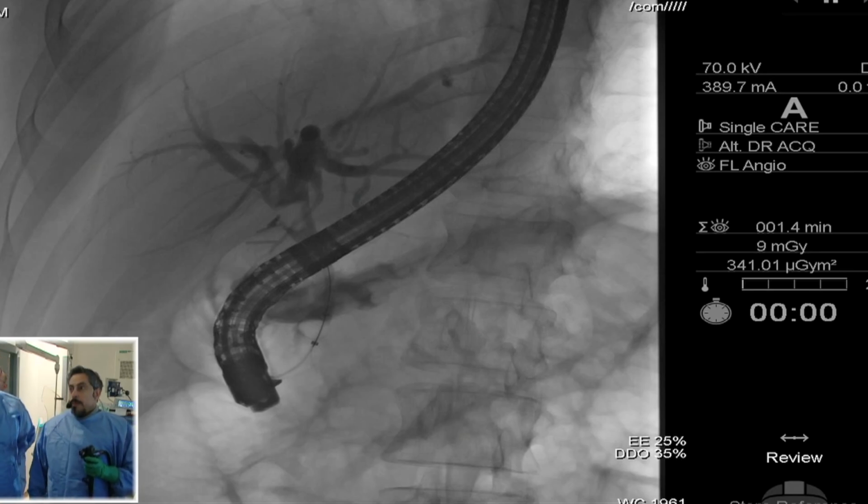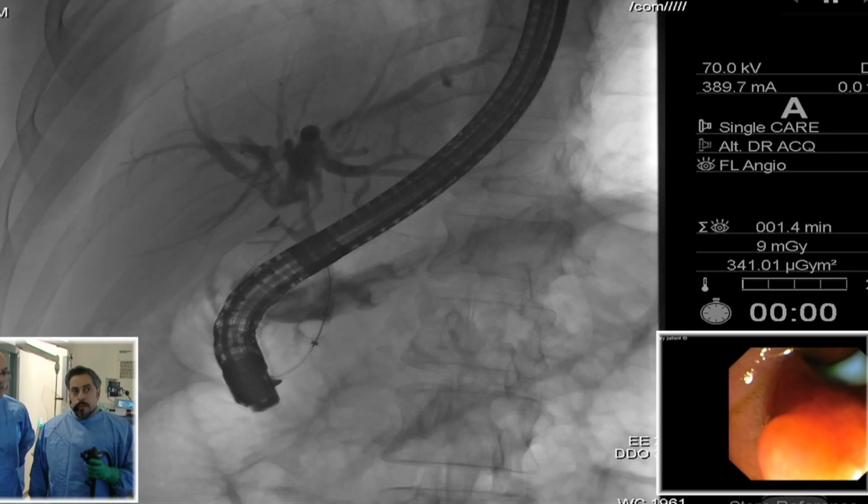So this patient, as you see in the cholangiogram, has this impacted stone in the common hepatic duct with distal narrowing also of the CBD. So it would be a tough procedure for ordinary extraction of this stone by balloon extraction. And as you mentioned, I think this patient has had previous ERCP with 2 trials of EHL.